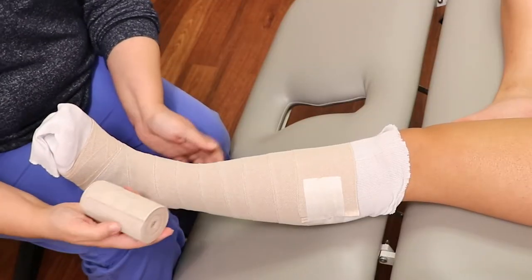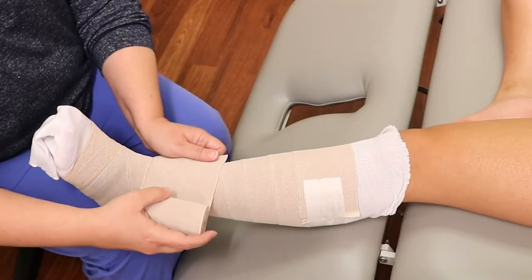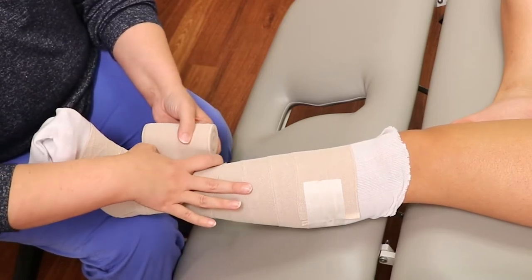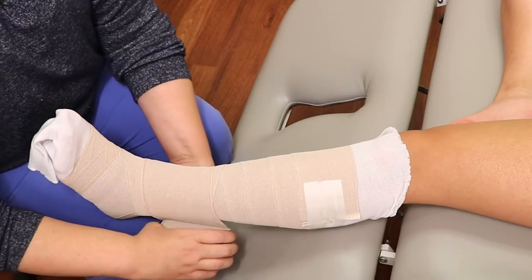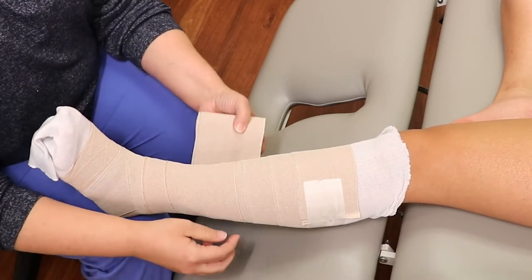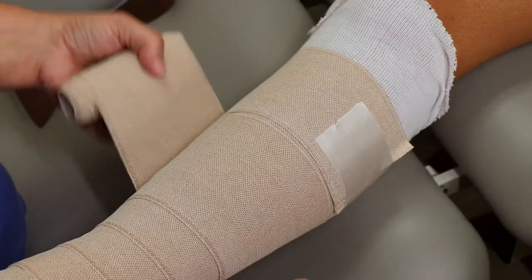With your last bandage — your tallest bandage — begin again at your ankle and overlap by half the width of the bandage as you continue up the leg.